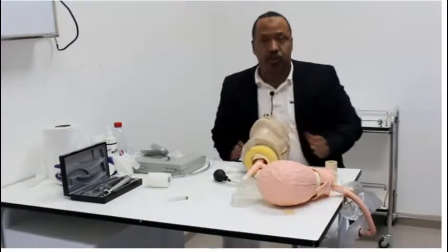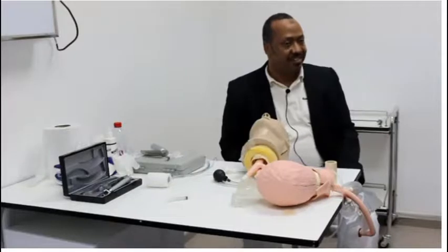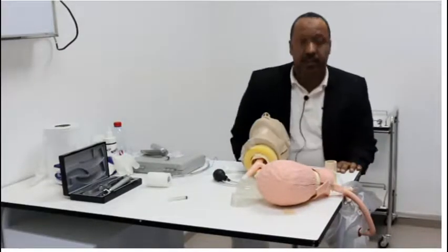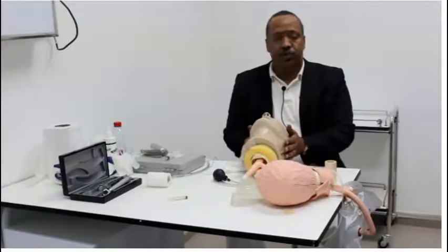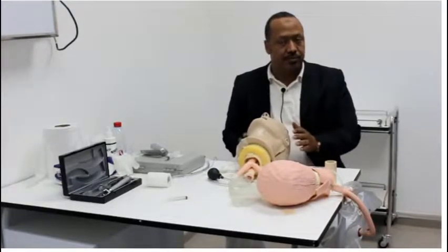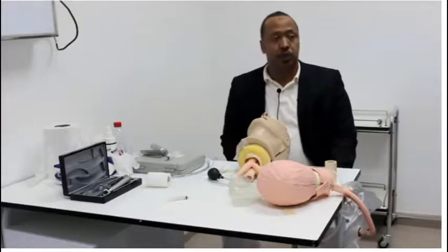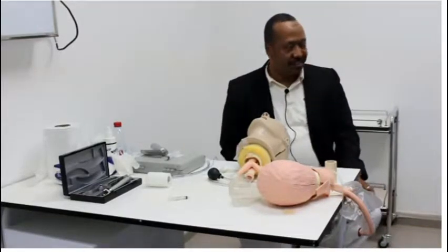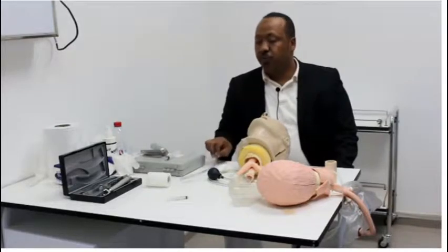This is the station of tracheal intubation. There are so many indications for use of this procedure. There are very important things to do in tracheal intubation.